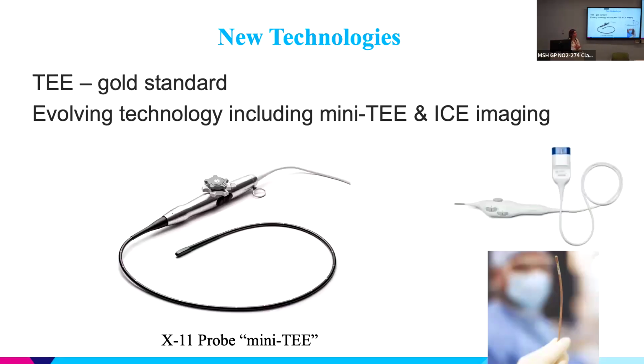So just to start off, when we talk about valvular disease and especially structural heart in particular, getting a 3D TEE is incredibly important. It's part of our workflow. Pretty much almost every patient will need some sort of good echo, whether it's a transthoracic or TEE, prior to structural heart intervention. And we now have this new probe. It's the X11 probe, and this was commercially released about a year ago now.